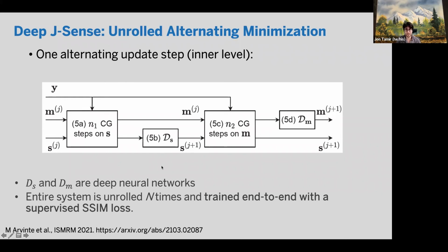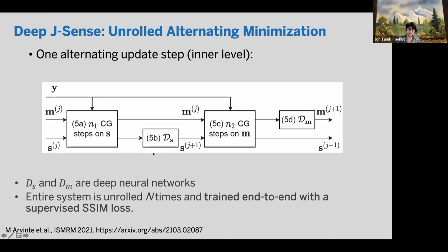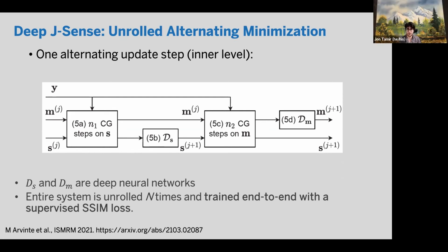And the way we've done it in this work is we put the coils in the batch dimension so that we're not actually explicitly taking advantage of all of the correlation among the maps, but instead we get away with this permutation invariance. Yeah, if we didn't have the permutation invariance, what we've seen is that we'll actually start memorizing the coil maps. And so if you permute the order, the network will try to smooth out the maps to look like what it expects. So that's a really important distinction to make.